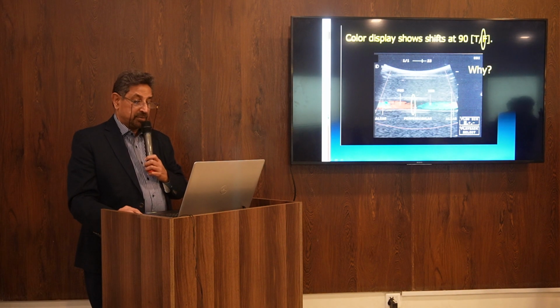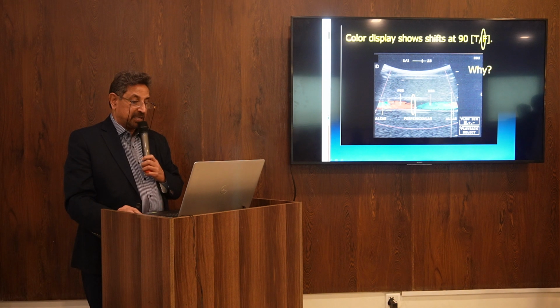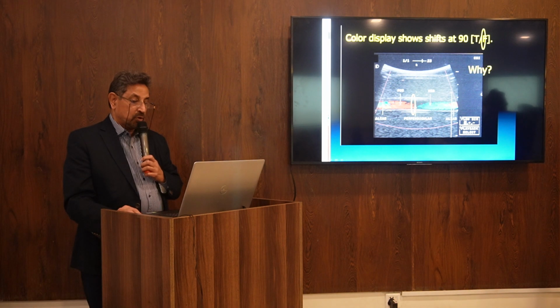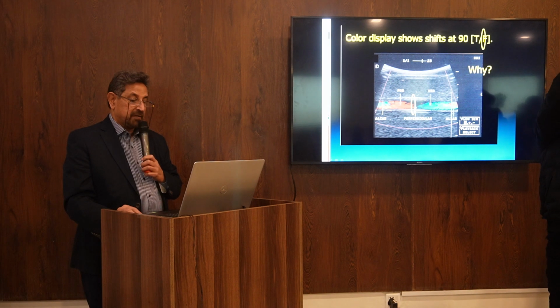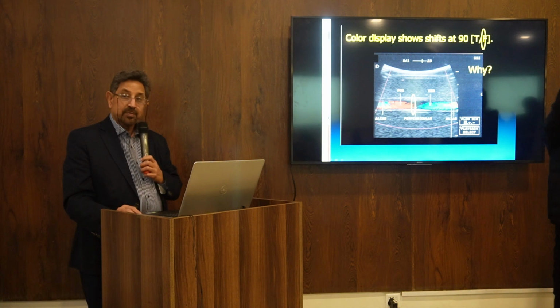Very important point. You see here the ultrasound beam is striking this vessel at an angle. You are getting the highest frequencies. The angle is highest. You see the probe is here. These green, yellow colors are reflecting very high frequencies. And here is red, a sufficiently good frequency. The moment we come to 90 degrees, no color is seen, so no flow.